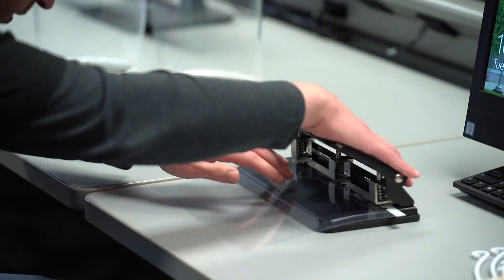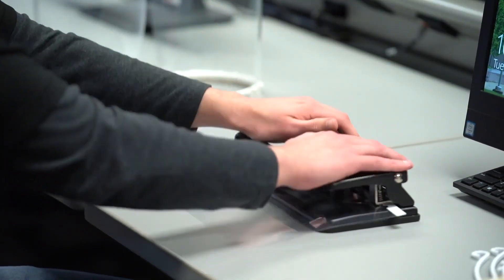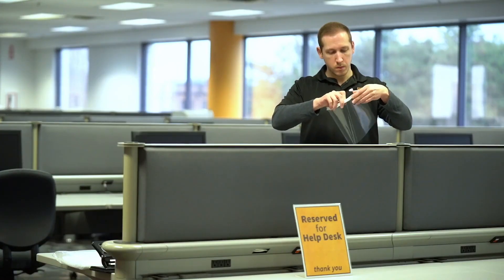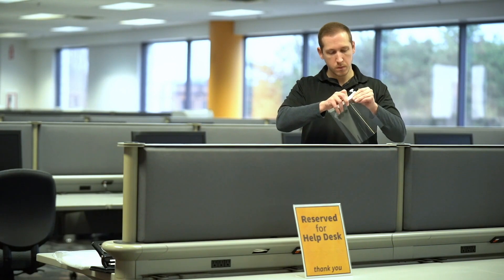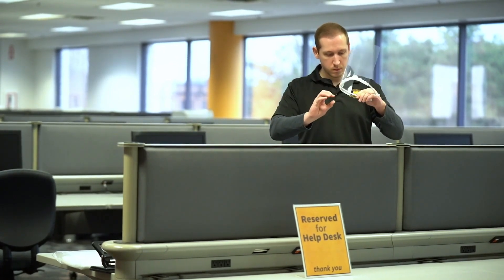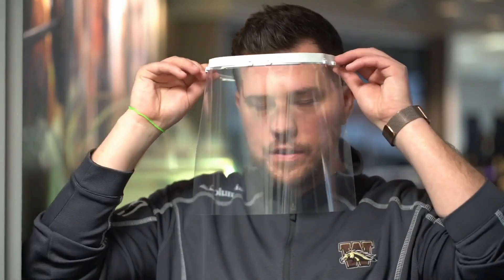This is the design that we're using, and it was actually provided to us by a maker over in Sweden. This is the end result after we 3D print it. The next step is to three-hole punch into this transparency, which allows us to connect the transparency to the 3D printed bracket. After we assemble it, the end result is a 3D printed face shield that's very similar to what's used in hospitals today.